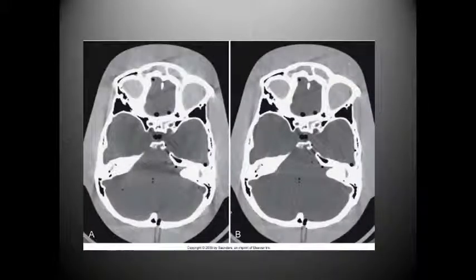The reason beam hardening can be detrimental to the patient is simply what we have here versus image B. It would be very easy to mistake this for some type of lesion or mass, whereas if it's corrected, like on image B, we can clearly see that there is no mass there. And so you don't want to mistake the patient for having an ischemic stroke, things like this, simply because of artifacts or evidence. And so that's what we seek to remove, and why we seek to remove beam hardening.